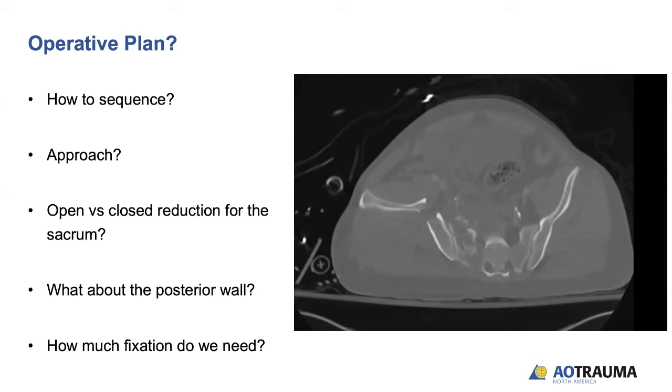So I would probably start prone, go posterior, and reduce the sacrum. With zone 2 sacral fractures with bone quality and high energy like this, I commonly will use also spinal pelvic fixation, which may not be a bad idea because you're going to really start to bring the anterior column back to the intact ilium, which will take some force, and it may have some challenges with your iliosacral screw fixation alone.